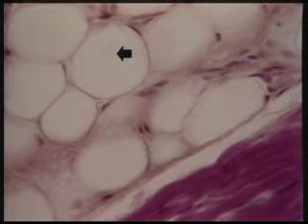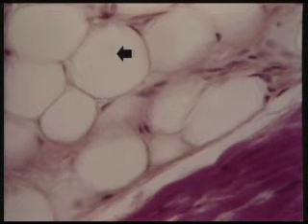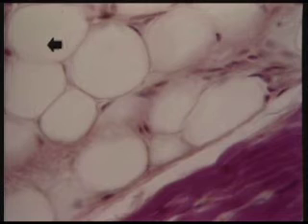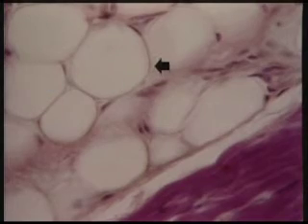Question number 8. What kind of cell is the arrow sitting in right here? That is a fat cell, or adipocyte. Here's another one over here, and another one over here. In the light microscope, in standard H&E preparations, these fat cells tend to look sort of like soap bubbles.